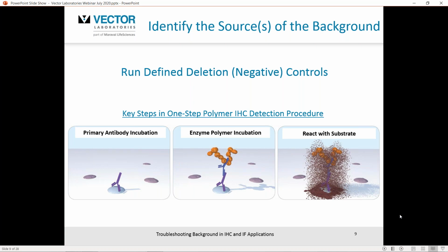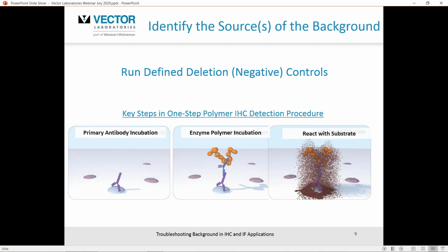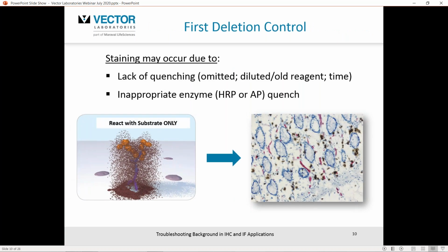So number 1 is you start with the back of the assay with the color development part. So your first deletion control, again, omitting primary and your secondary detection reagent, you put on just the substrate alone and see if there's any color development. Indeed, if there is staining, it may be due to lack of quenching, possibly inadvertently omitted. It's old reagent, or it needs to be further concentrated, or indeed there may be a time issue.